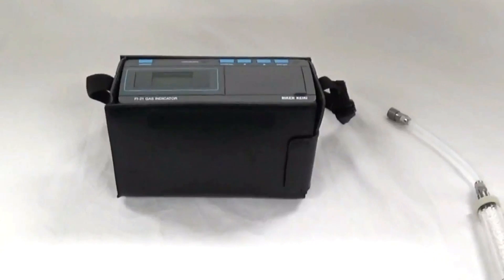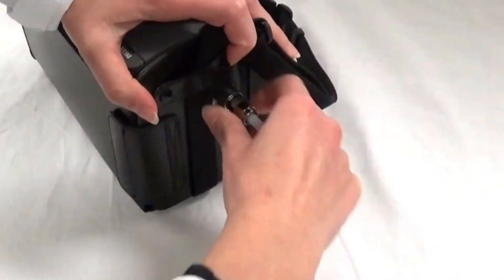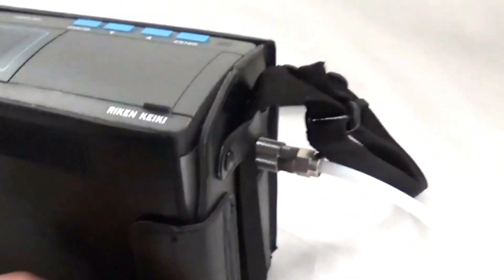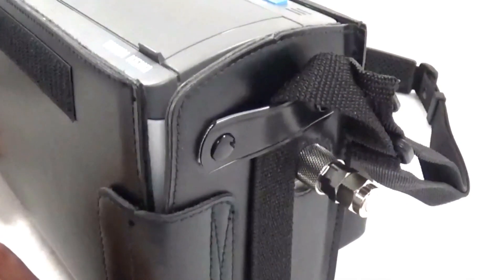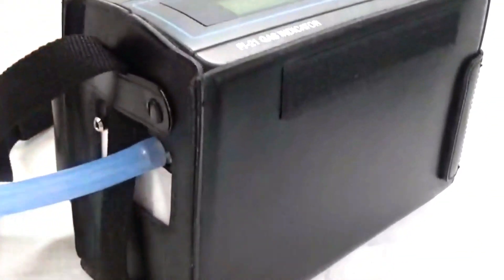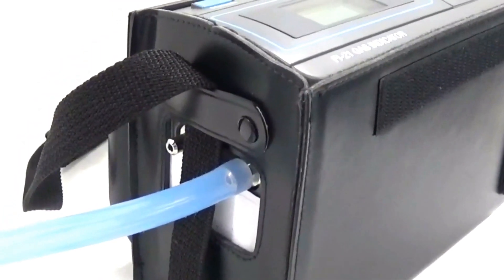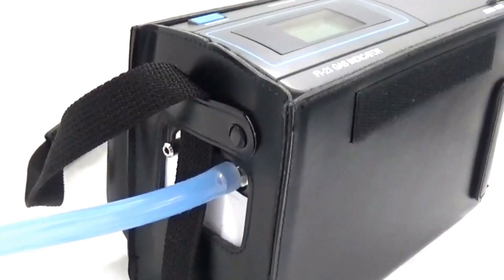We will now connect the gas sampling line to the Riken, and then connect the scavenging tube to the port labeled Gas Out. There are two ports — Reference Out and Gas Out — and it is important to connect to the Gas Out on this particular unit.